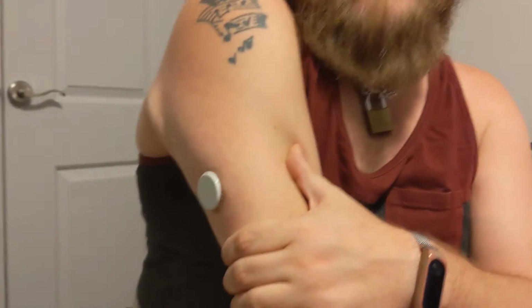So tonight is actually replacement night. So I probably should go into that. These sensors last 14 days. One sensor lasts 14 days.